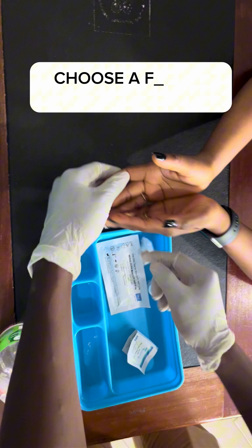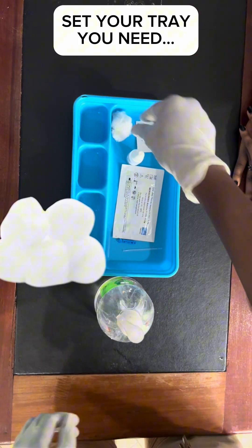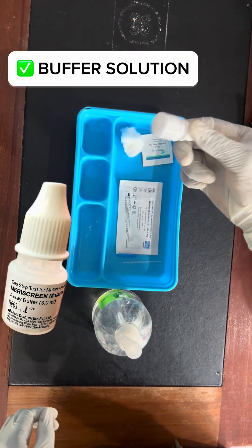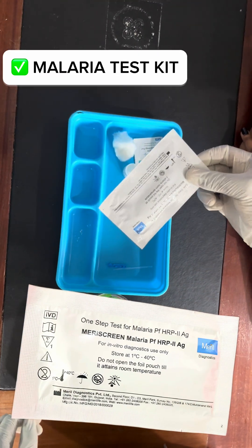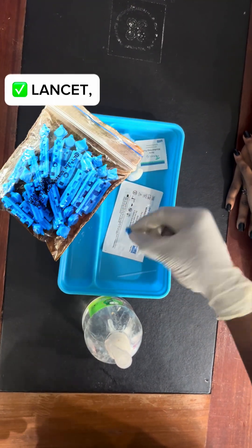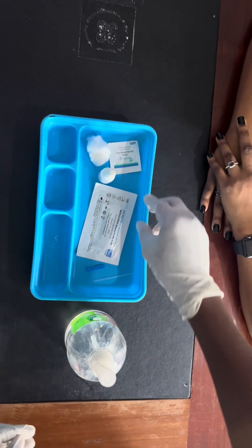Choose a finger for the finger prick. Set your tray, and on the tray you'll need: a dry cotton, alcohol swab, buffer solution, malaria test kit, specimen transfer device, lancet, alcohol-based hand rub, sharp box, and timer.